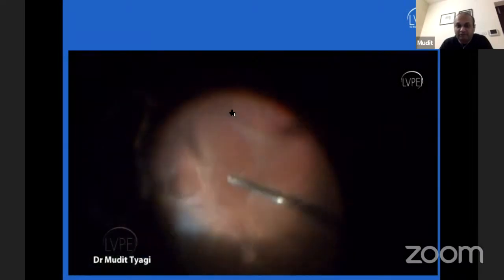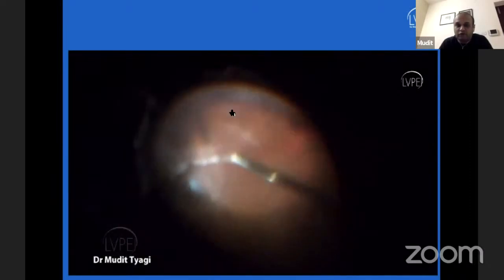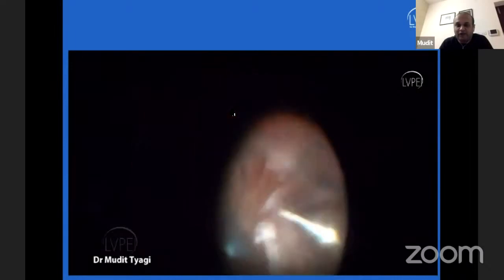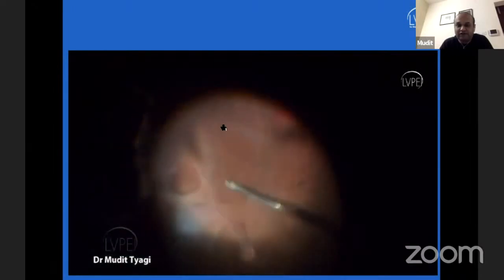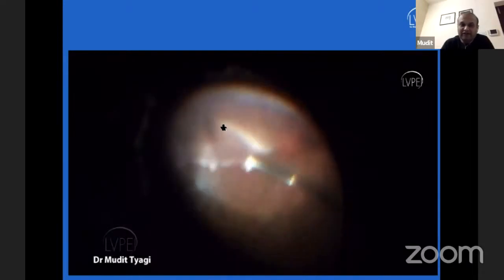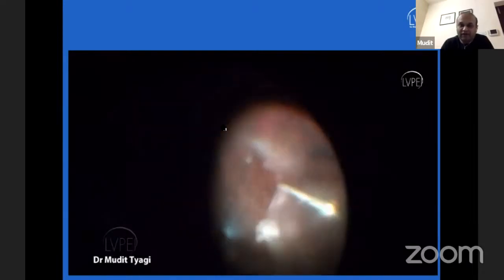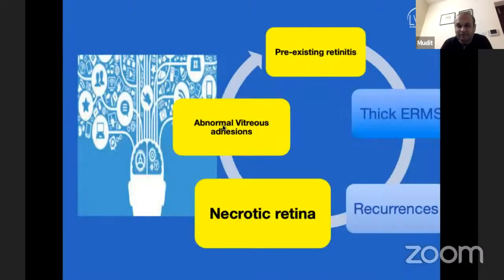The third point is that, again, if you look at this, the vitreous is extremely thick. And you sometimes need to not pull it, because if you pull, you will end up creating more iatrogenic breaks. The ideal way is to shave them as much as you possibly and safely can. You can go ahead with the help of a 25 gauge cutter. You can easily go underneath them and truncate this vitreous, cut it as close as you can to relieve the traction. The idea is to get rid of this tendency to pull at them, because if you pull upon them, they are so thickly adherent, you will end up creating more breaks in the periphery. So you have to be careful while shaving these peripheral vitreous bands. That is the way it is different from other detachments.